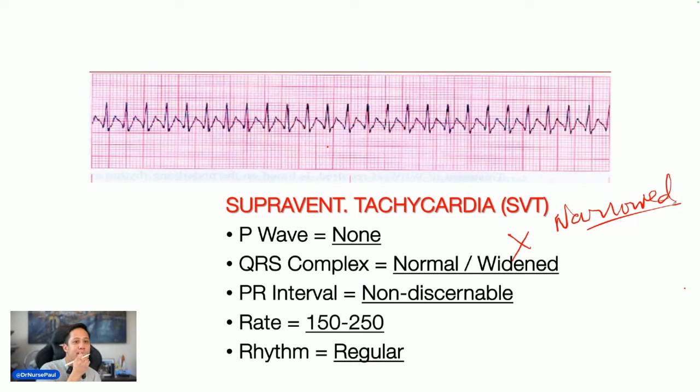All right, what's the difference? Can anyone tell me? Observe. Very good, Evanard or Jay. Can I mention your name live? The only difference is in SVTs, there's no P, right? In sinus tachycardia, because they can also go up to 200s, there is a P wave. Remember, in sinus, everything's normal except rate. That's sinus tachycardia. In SVT there's no P wave, or the P wave is at the same time as T, P and T already joined together. That's supraventricular tachycardia. That's it. SVTs, no P wave. Sinus tachycardia has a P wave, because sometimes they look the same.